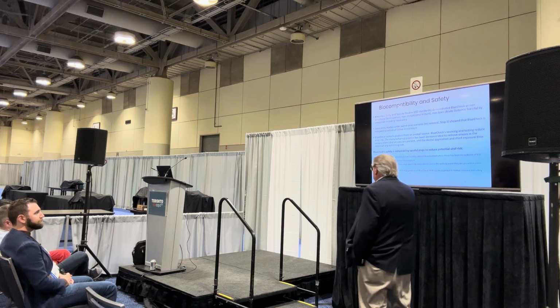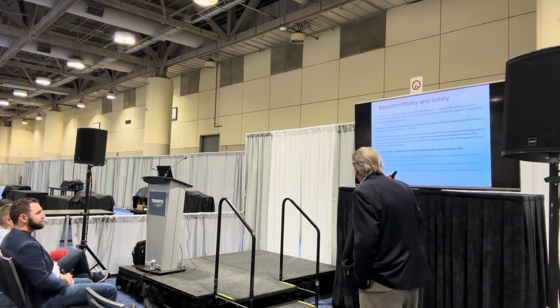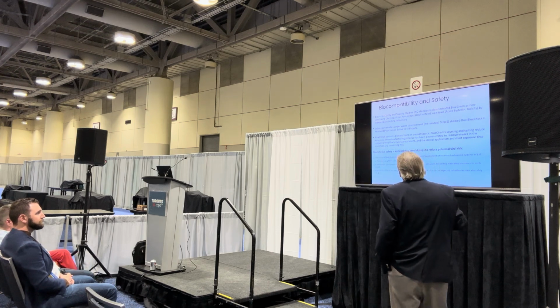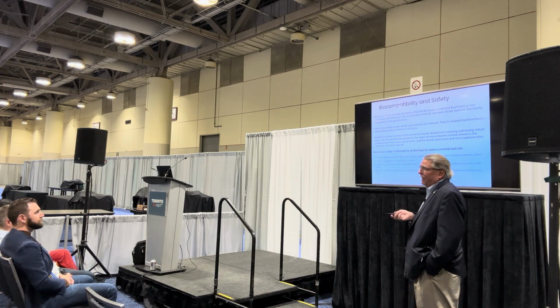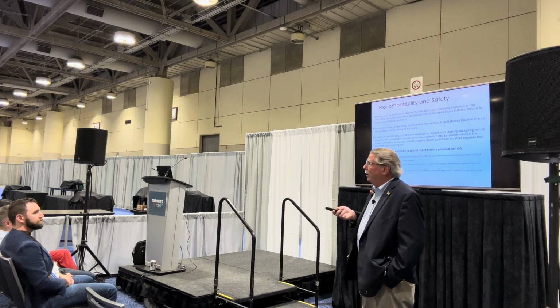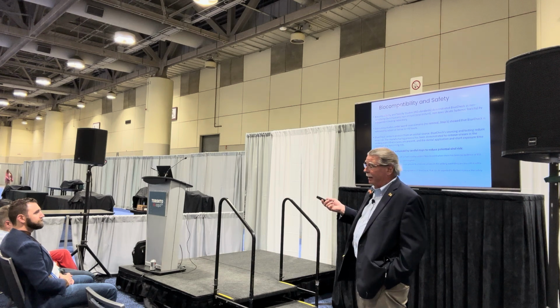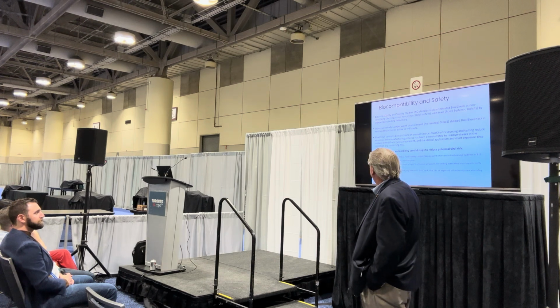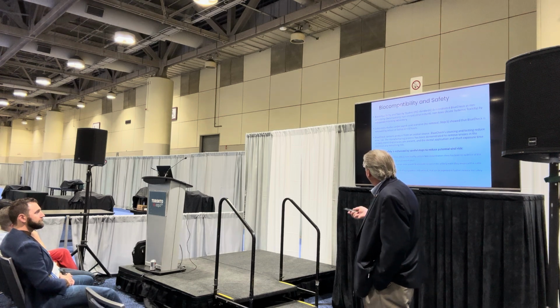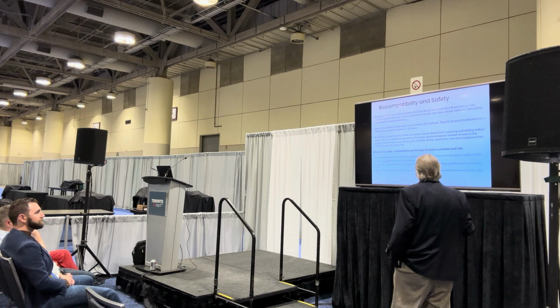So I put this slide in. This is from Insights for Technology. They were very kind to provide this. As you know, to get FDA clearance, and I don't know if all of you know that, you have to show biocompatibility. It's mandatory by the FDA. So you have to show it's biocompatible. It is. They've done studies for both toxicity and biocompatibility, as must be done.